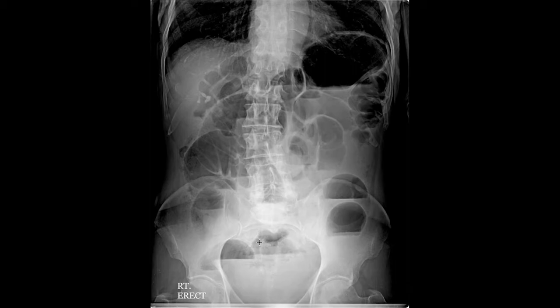Air, as we said, since it goes against the gravitational force, it will go upwards. See here, air is going up, while fluid is left down. You see here, air fluid levels. See the lines here. There are many lines. These lines separate the density of the air from the density of the fluid.